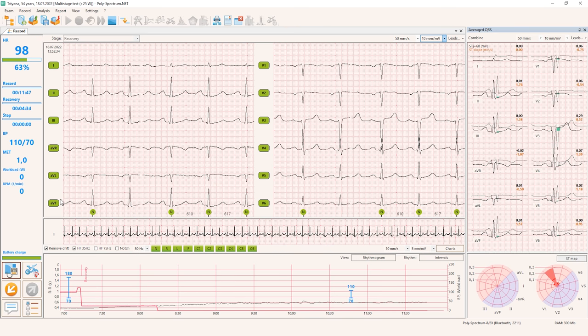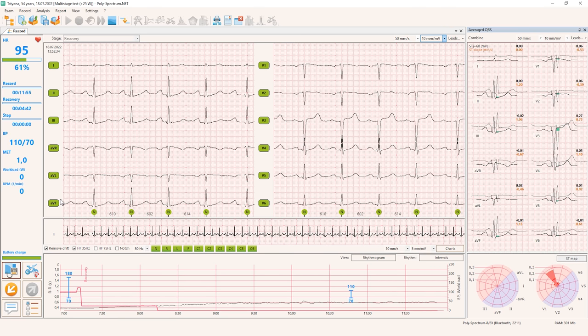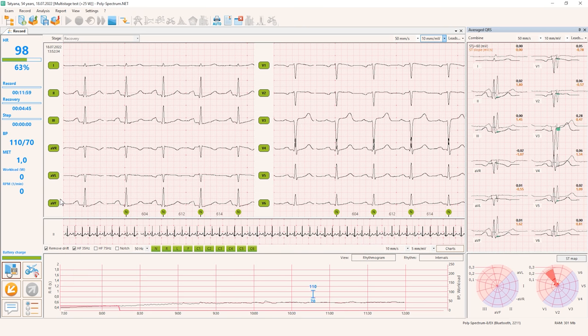And also we wait to see if maybe some new things arise during the recovery period, because the recovery is not a passive process, it's an active thing, because the autonomic nervous system tries to restore the blood circulation after the exercise, and we have increase in parasympathetic flow and decrease in sympathetic nervous system activity. If these branches of the autonomic nervous system do not react according to the current situation in the blood circulation in the body, you can see maybe drops in blood pressure, maybe even syncope, or some arrhythmia arises. So that period may be interesting. Even sometimes you can see delayed ischemia. Yes, in some patients you can see that.